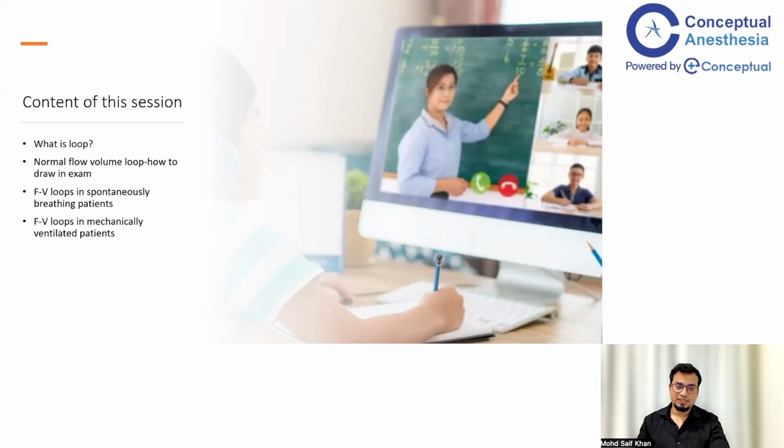And we also know that this is part of ventilator graphics in patients who are on a mechanical ventilator, even patients who are uncooperative. Obviously, in such patients, we can obtain flow volume loops on the ventilator screen as a part of our ventilator management, along with the volume scalars and loop analysis.